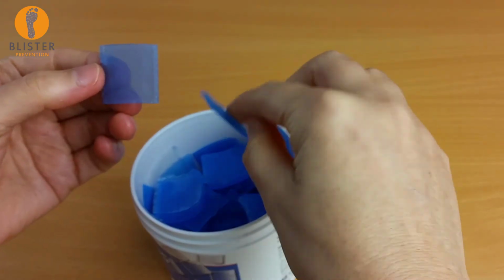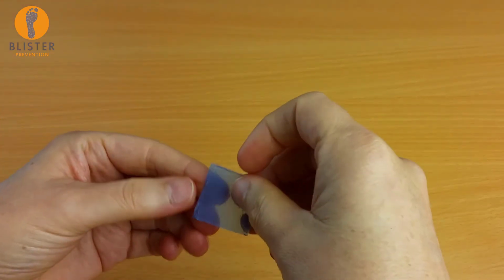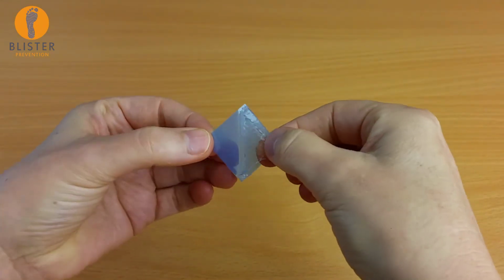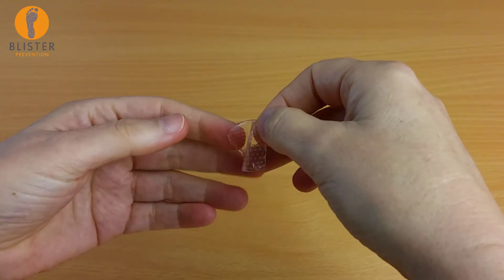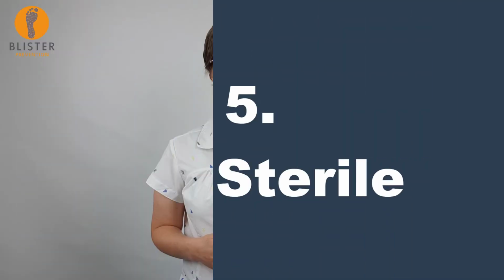However, in the tub of squares, while they all have the blue plastic on one side, they don't all have the clear plastic on the other side. I don't know if that means that you leave the blue plastic on instead and put the sticky side to your skin, effectively putting it on upside down. I'm not sure if that makes a difference functionally. I just know that if you don't have any plastic between the gel and your tape, it dries out real quick.